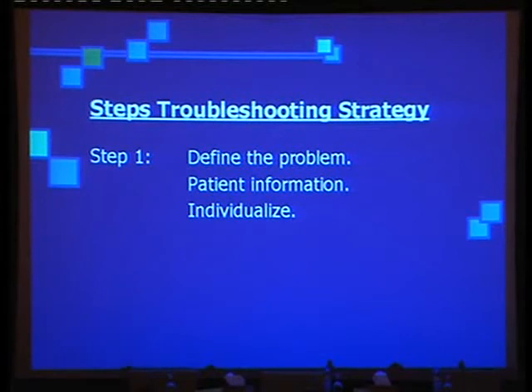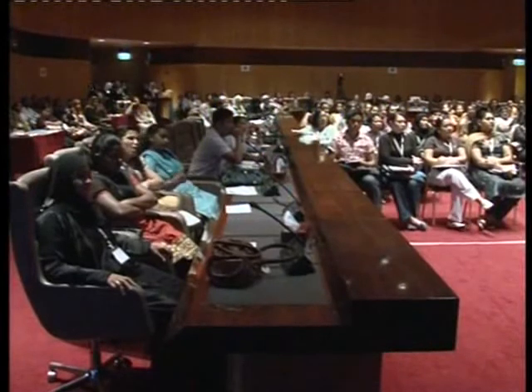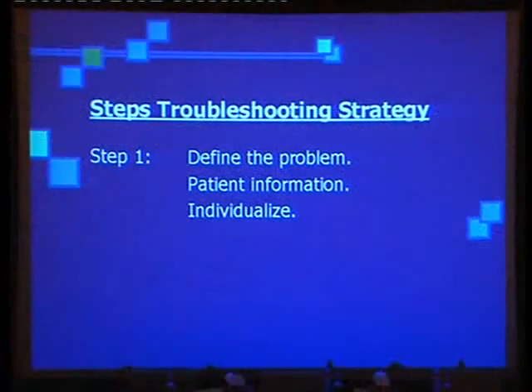Many times from my experience, I've been called to the units because the pacemaker post-implantation is not working, and people easily go to conclusions. So our advice for our colleagues is to look at other alternative leads or to call for a 12-lead ECG. This is one thing. Second thing, they should look at the underlying rhythm of the patient.